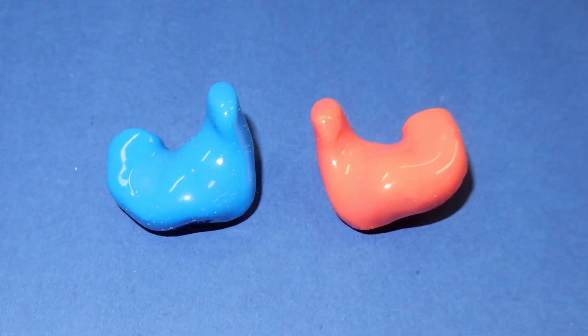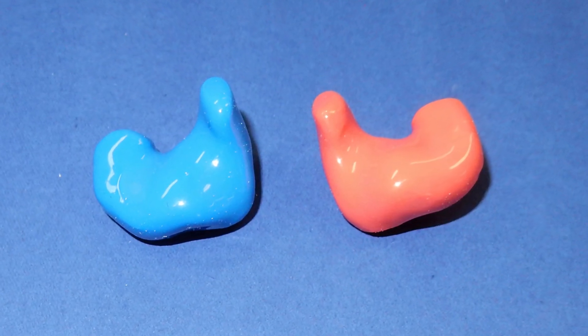The impression is then sent off to the manufacturer to make your earplug, which will be custom made to the shape of your ear. This will give you the best fit and the best outcome for your needs.